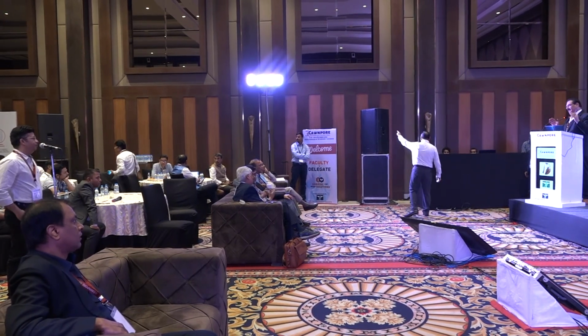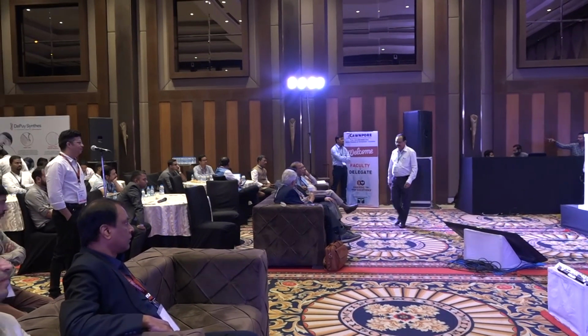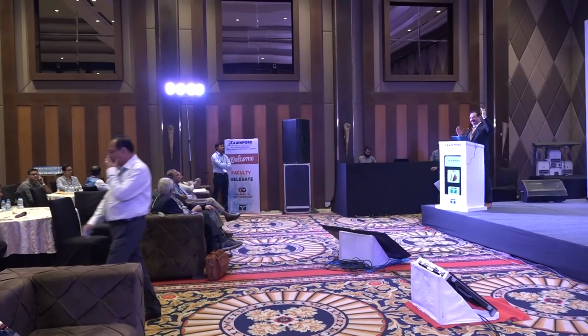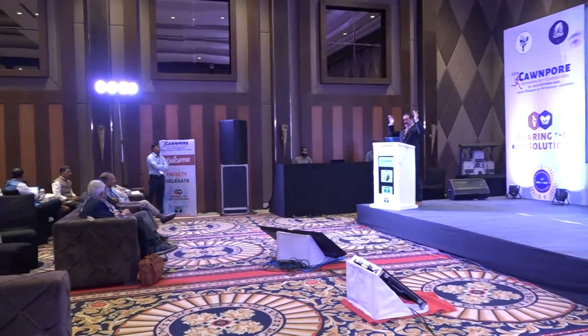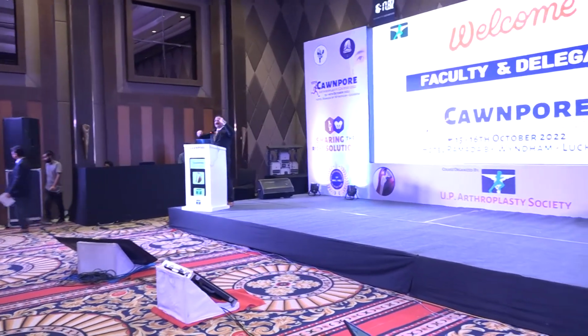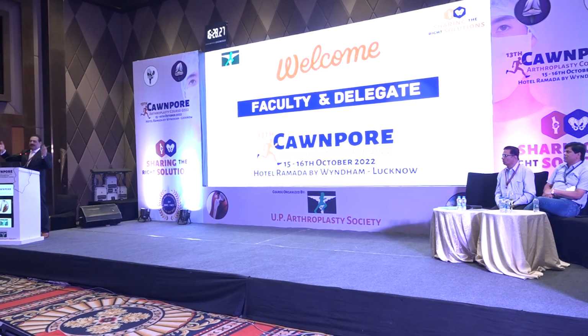Okay. So if there's a fixed pelvic tilt and the opposite hip is adducted, meaning the pelvis is up, this side, the operating side, is going to be down. You put a slightly open cup. And if it's just opposite, the other side is down and your operating side is up, then you put a slightly closed cup. If it is fixed, we are talking of fixed. If it is mobile, that's okay.